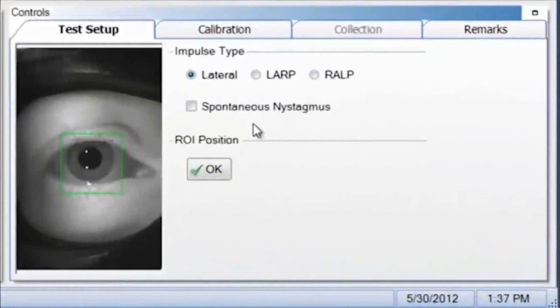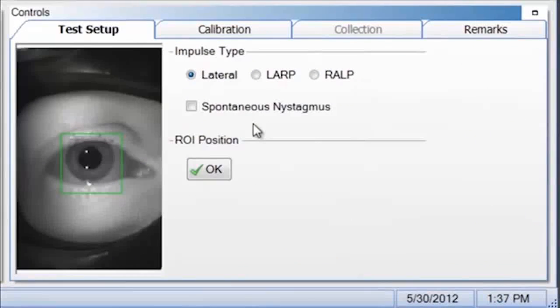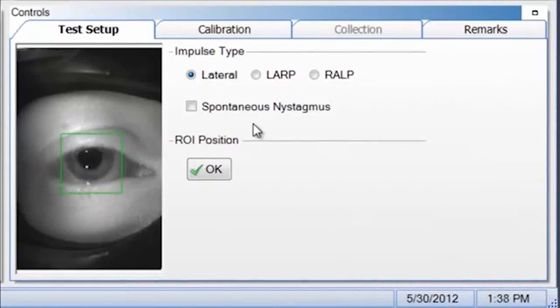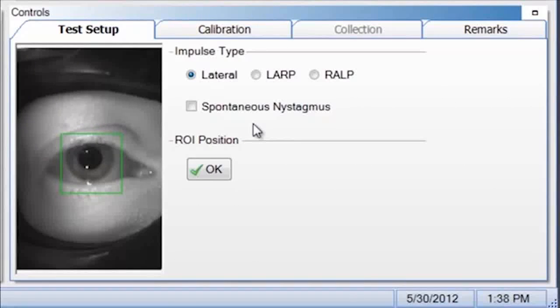For patients with spontaneous nystagmus, select the checkbox. Spontaneous nystagmus prevents good impulses from being rejected inappropriately.